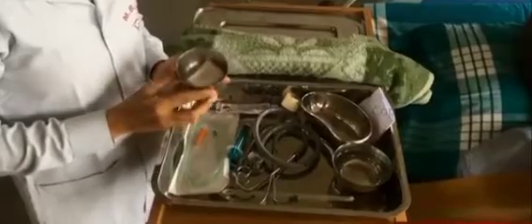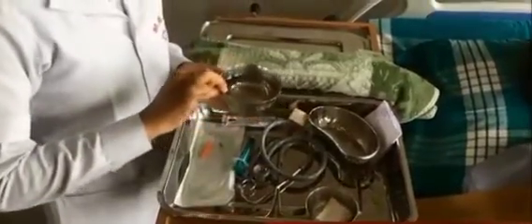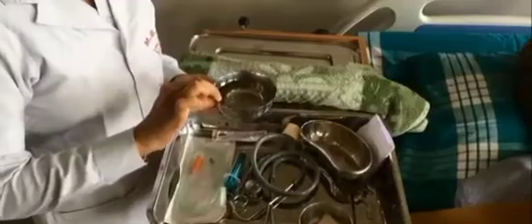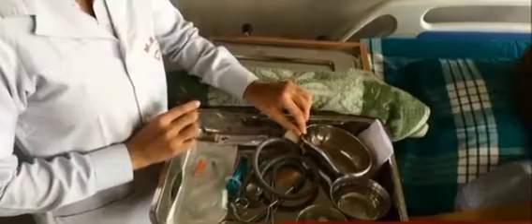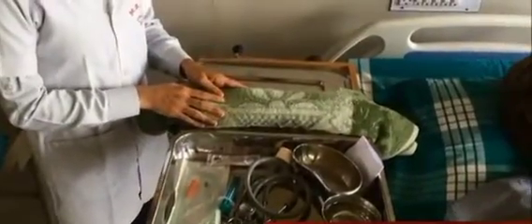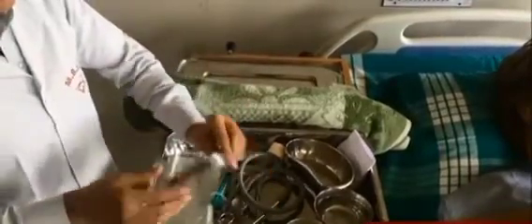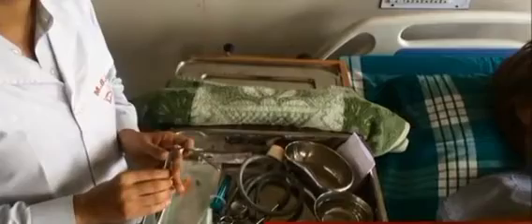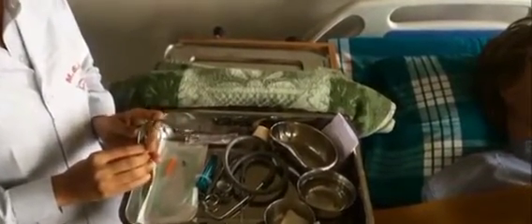One bowl with gauze pieces, for cleaning if any aspiration happens. One bowl with water, for checking the placement of the Ryle's tube. Kidney tray for collecting the wet material and the aspiration. Paper bag for the collection of dry waste material. A Macintosh with a towel for preventing the patient's clothes from getting wet. And a tongue depressor, if the patient is unconscious, to open the mouth and see that the Ryle's tube is not in the mouth.